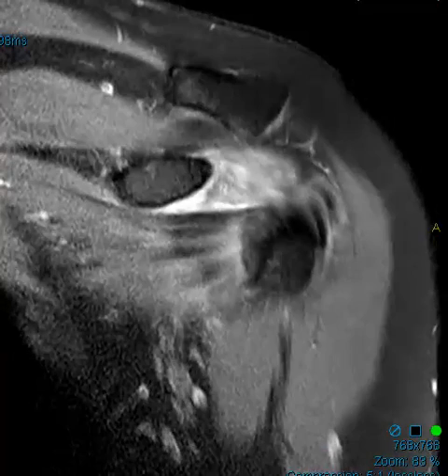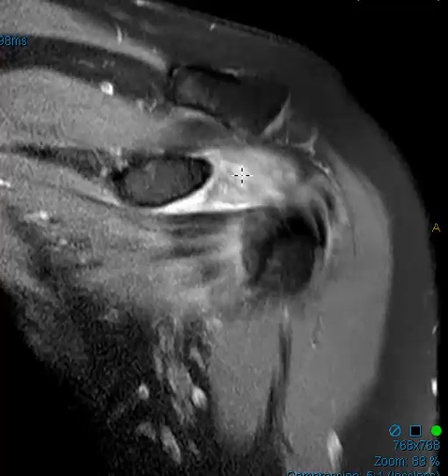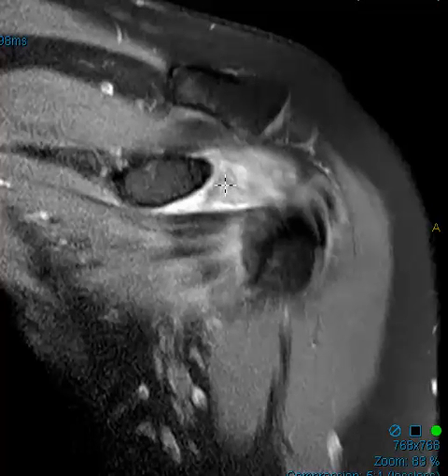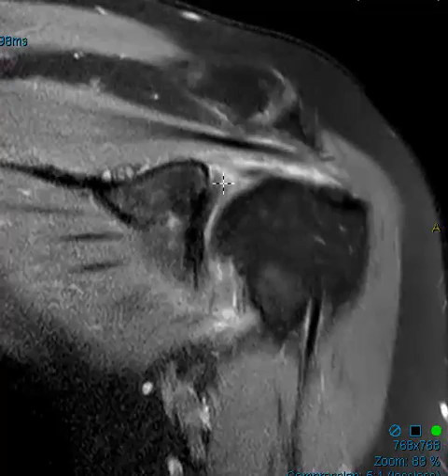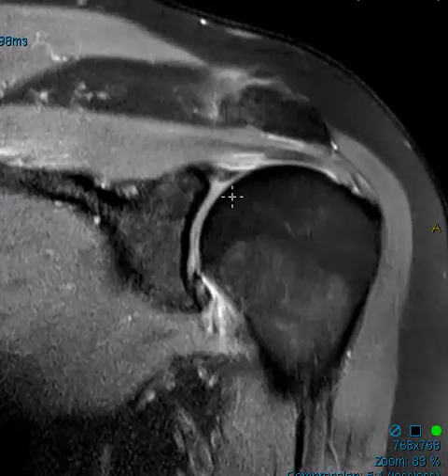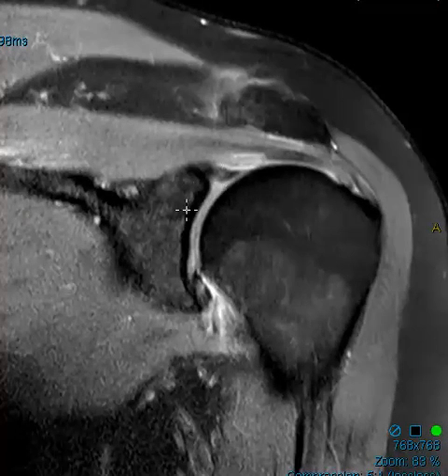On this view you can see the same area really bright and inflamed. This is really prominent — it usually doesn't stand out this much on the PD fat sat sequence. But when you see this fat obliterated, especially with inflammation like that, think of adhesive capsulitis.